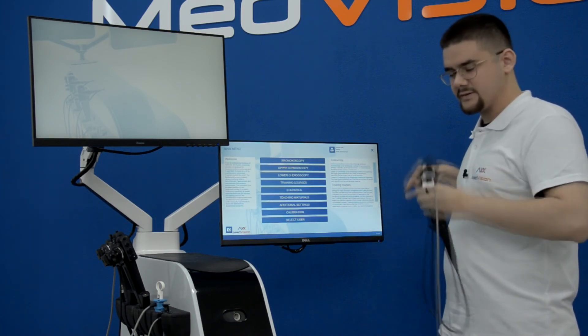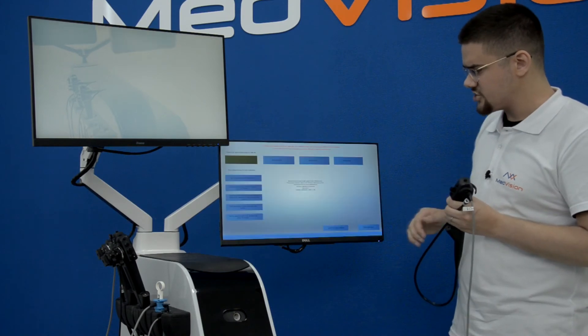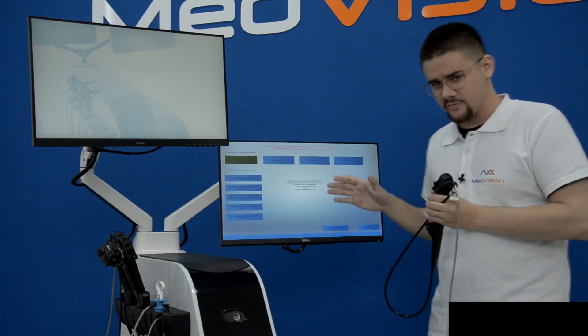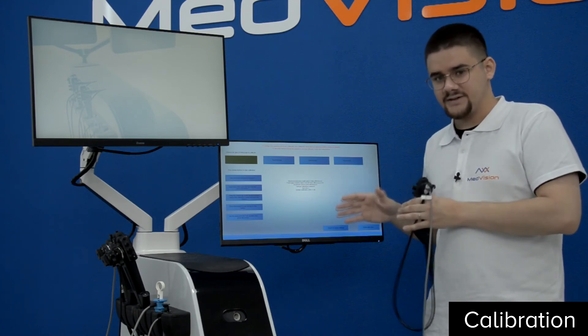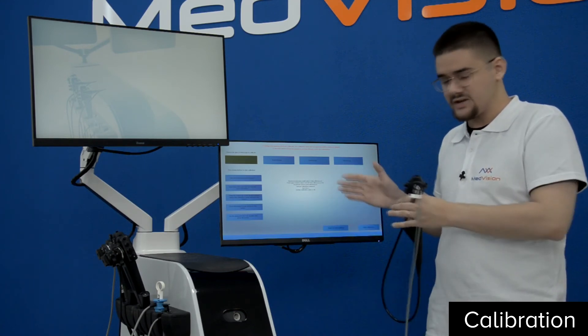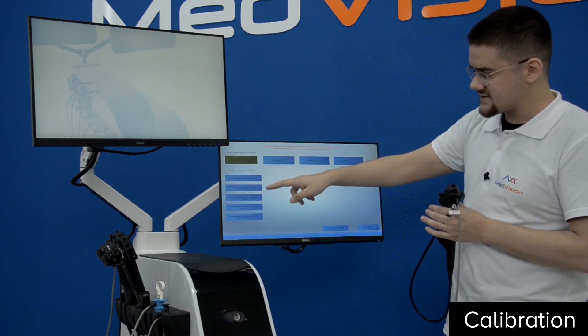We will cover monitor configuration in this video as well. Then there is calibration — very straightforward and oriented towards ease of use for your technicians at your simulation center, or you can even do it yourself. It does exactly what it says on the button.